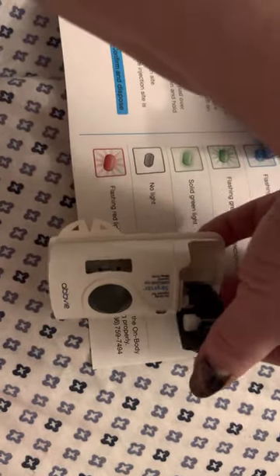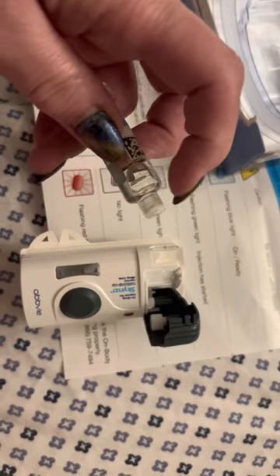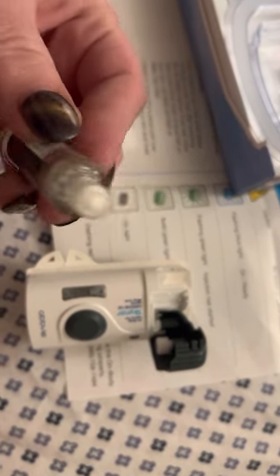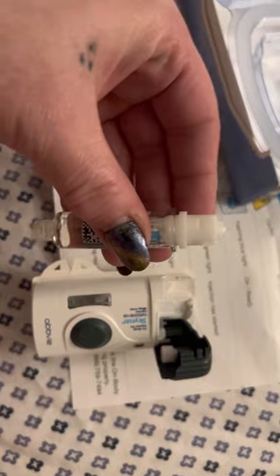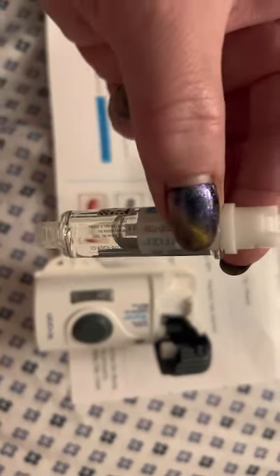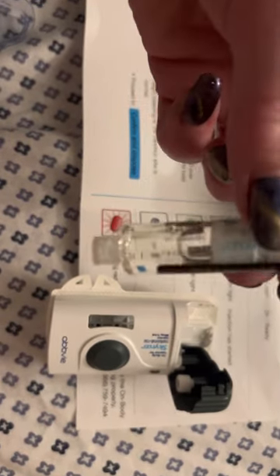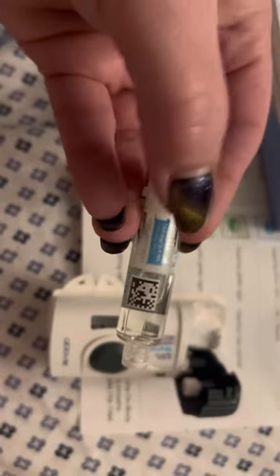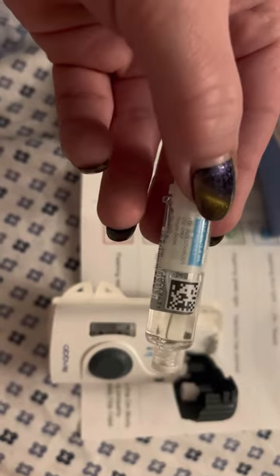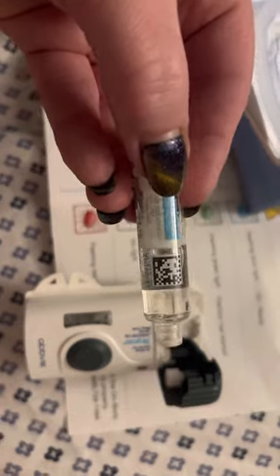So we're going to take the device — I already alcohol swabbed my injection site. I already cleaned off this end so I'm not going to touch it again, but you just need to inspect it and make sure it looks good. Do not mess with this. Make sure the fluid inside is not cloudy and not yellow. Make sure the expiration date is not bad. If you drop it, you've got to get a new one. If it's cracked or broken, call the pharmacy or doctor.